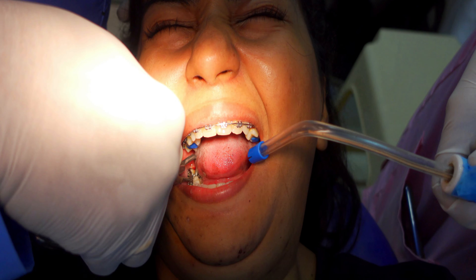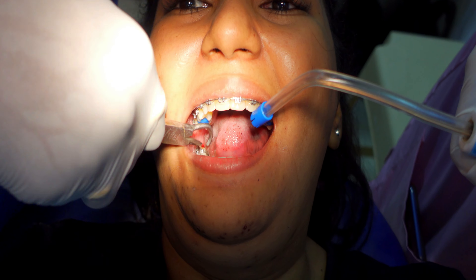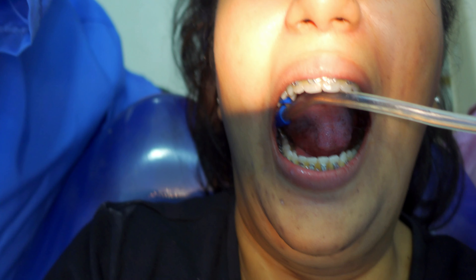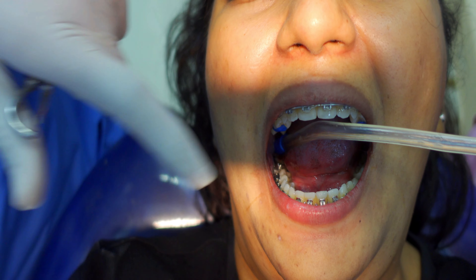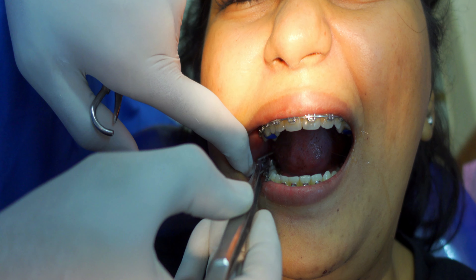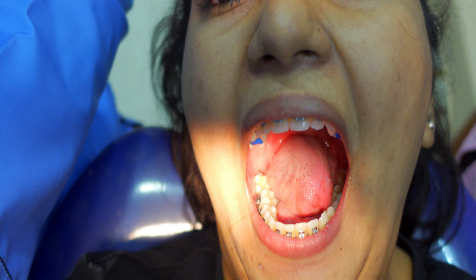After my tooth was numb, he started with the molar band again. He took the molar band and started applying it. When it pushes into your gums, it causes them to bleed and it gave me a lot of pain. There was a lot of saliva. Literally it was a very bad experience — I couldn't bear it at all.